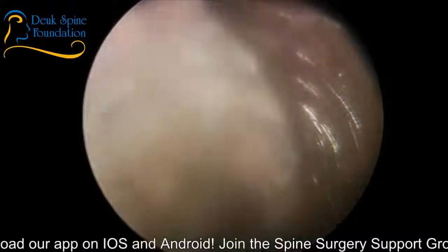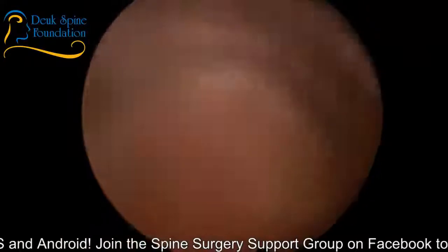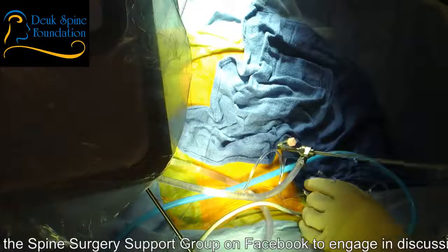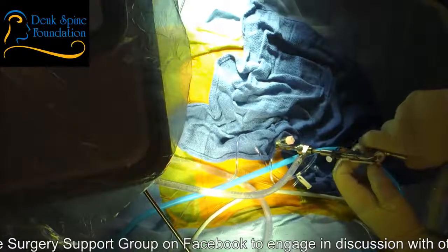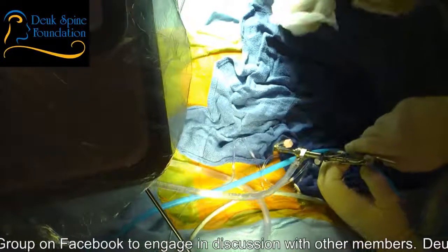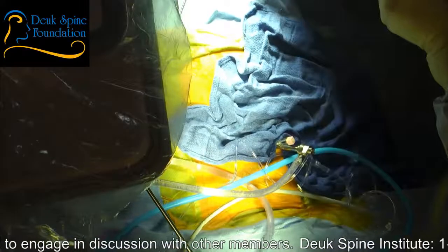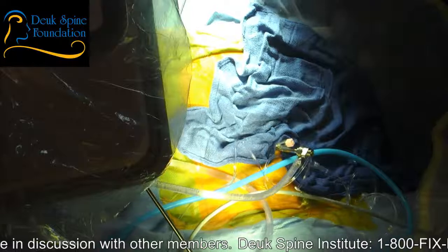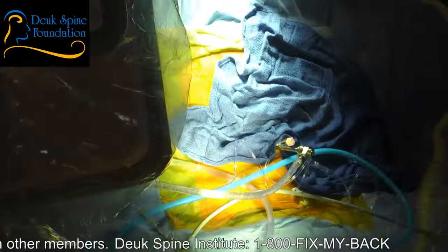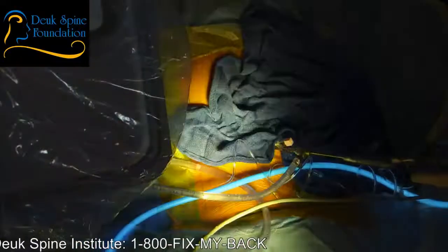All right, let's use our Grabzilla. Stand by. Scope off. Doctor, you doing all right? No. Let's see. Take that. Do not lose that. Let's get the scope back on and in. Right top, please. Thank you. Watch this.